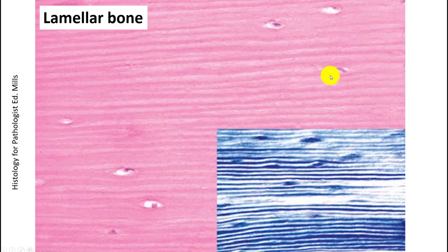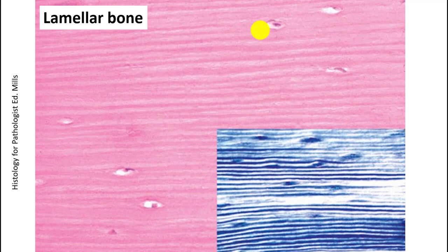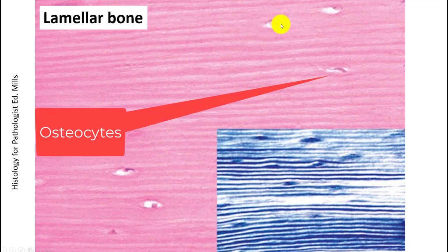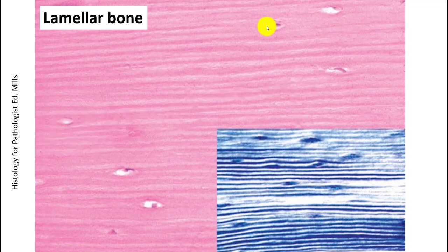Whether cancellous or cortical, all normal bone is arranged in what is referred to as the lamellar architecture — these parallel lamellae with a dark pink and light pink pattern. The osteocytes are oval-shaped and arranged parallel with the lamellae. You can highlight lamellar architecture with special stains or polarized light, but a simple trick is to crank down your condenser to see the lamellae much better.